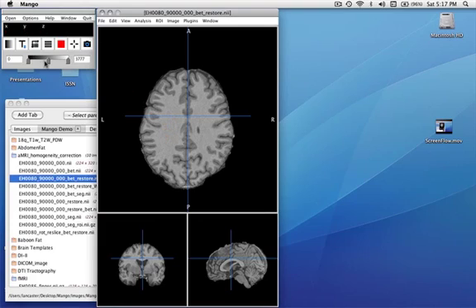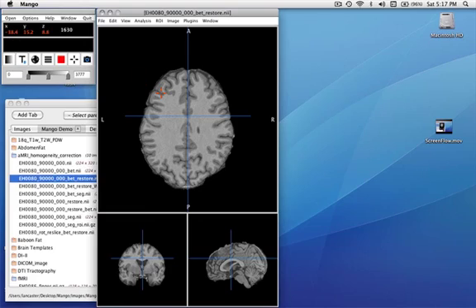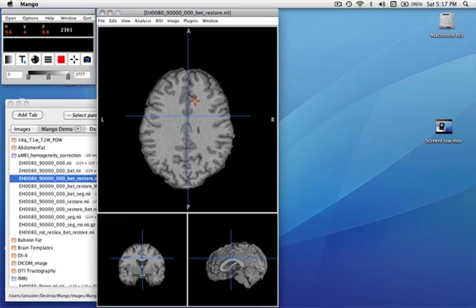As we switch to the world coordinate mode, we see that the coordinates now for X are negative to the left of the origin and right where the origin are positive, likewise above, below, and anterior and posterior.